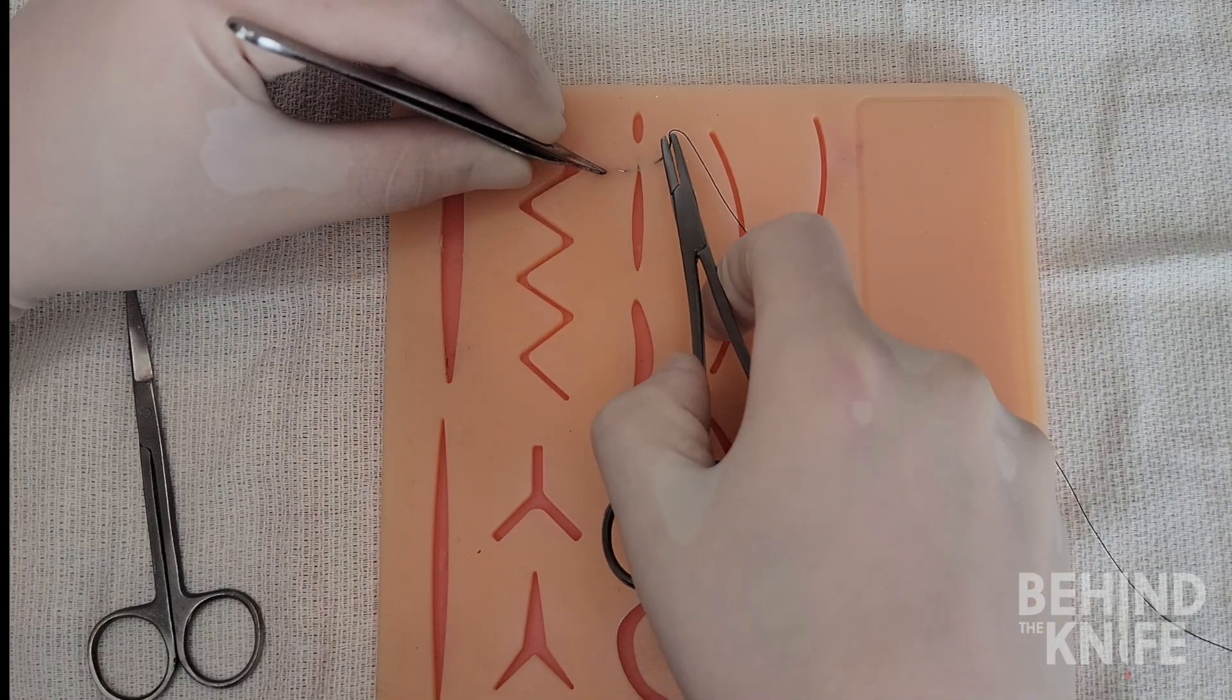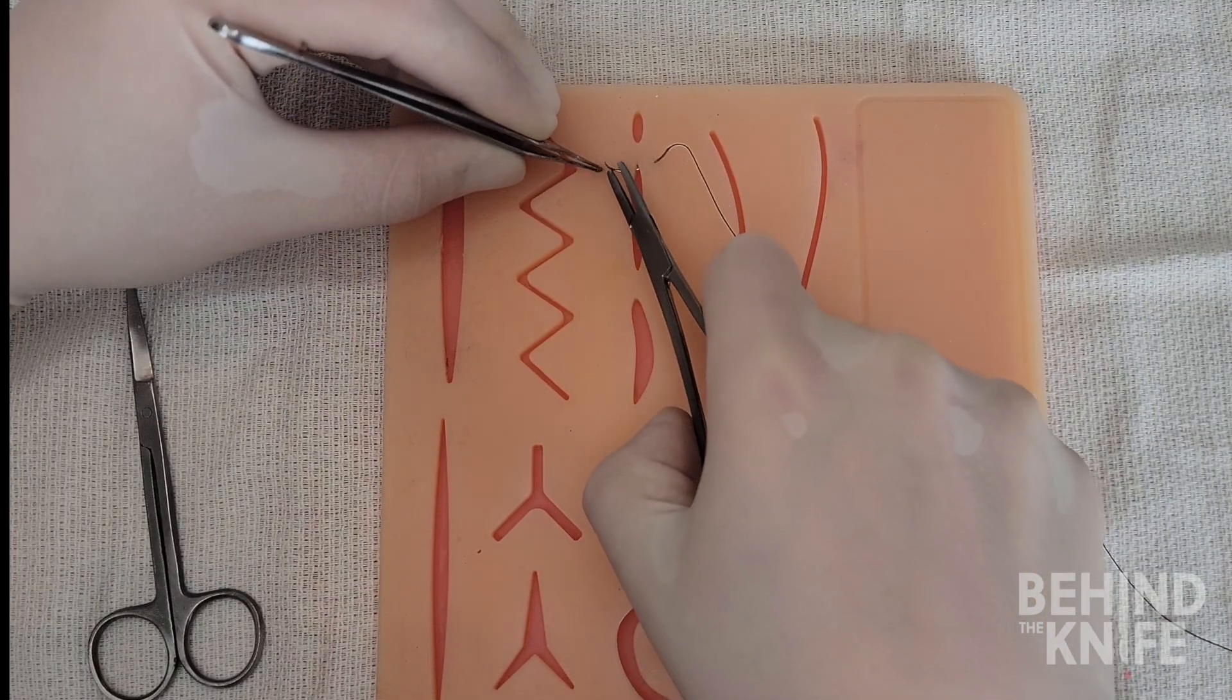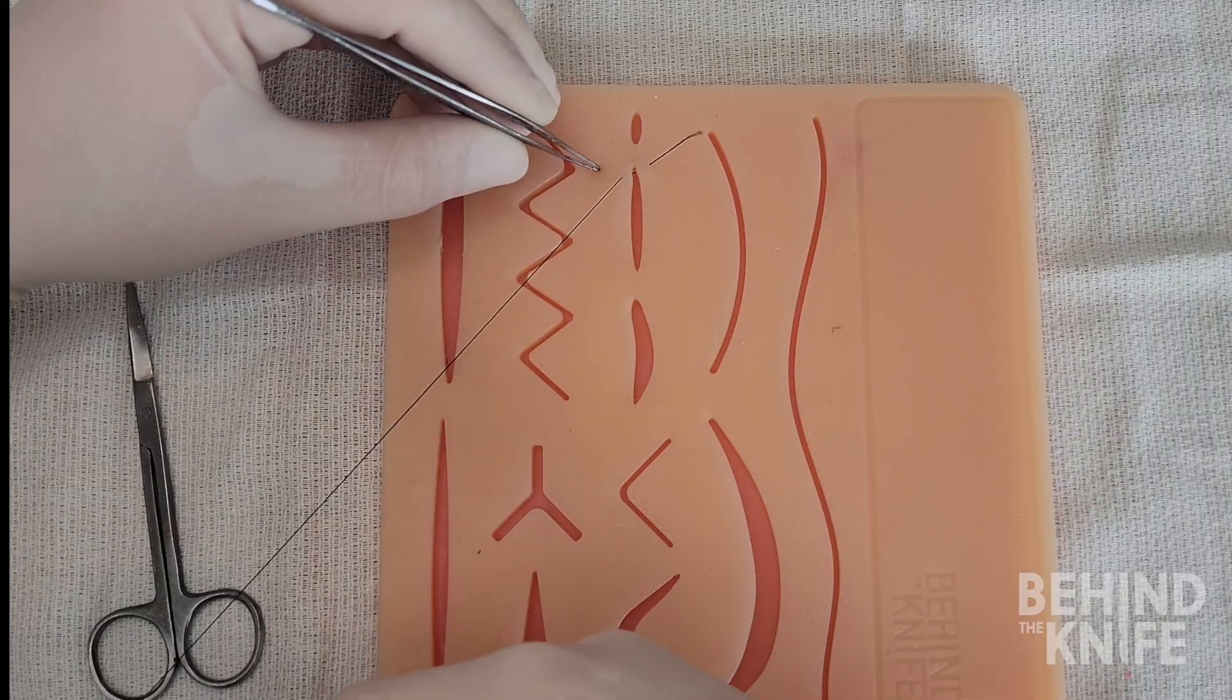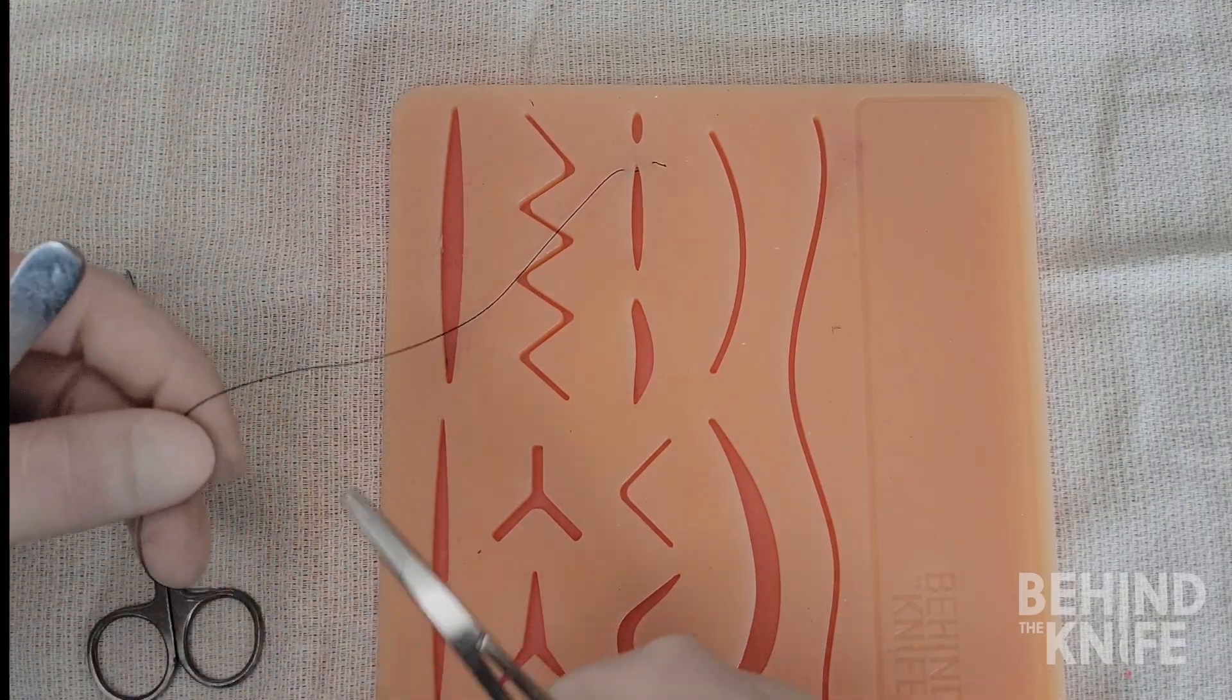The first part of the suture involves placing an anchoring stitch at the top of the wound. To do that we're going to perform a simple interrupted stitch here at the top.